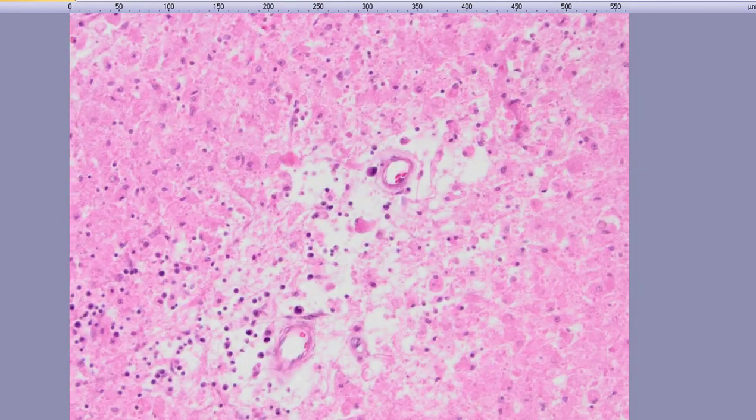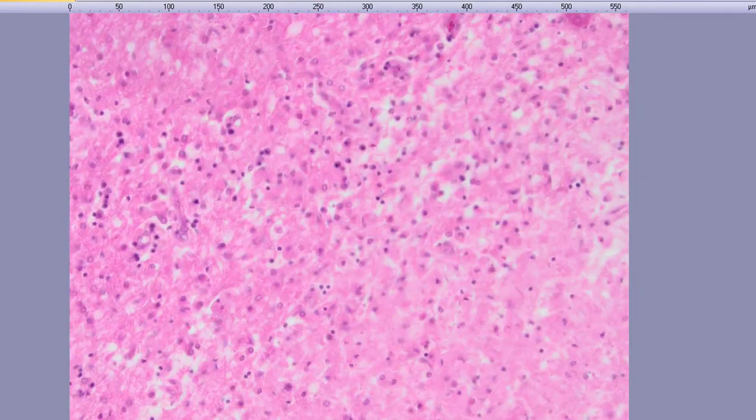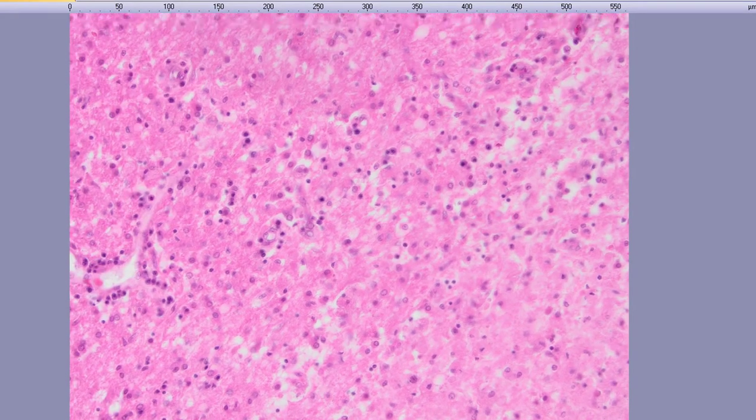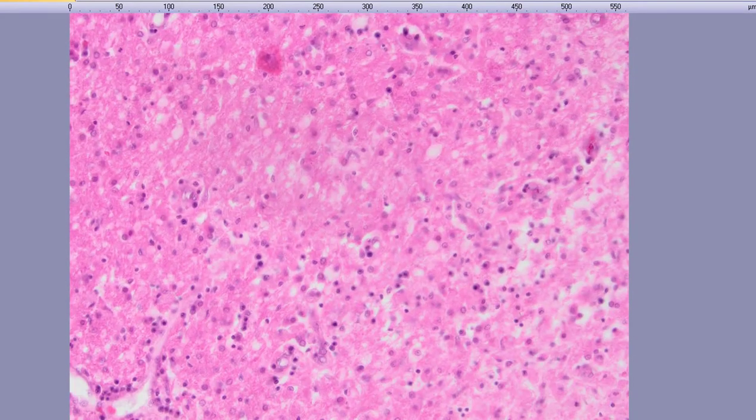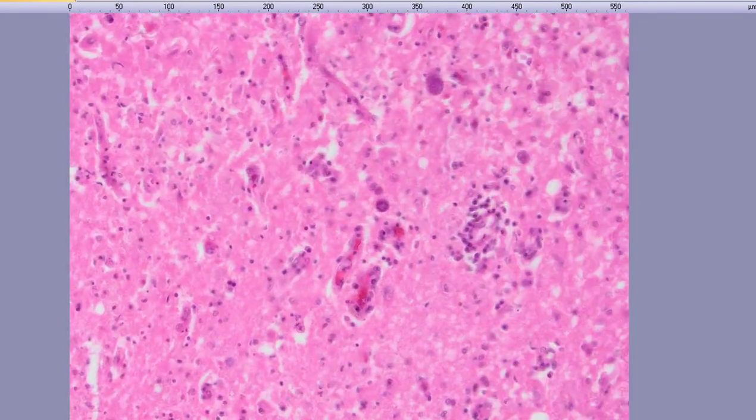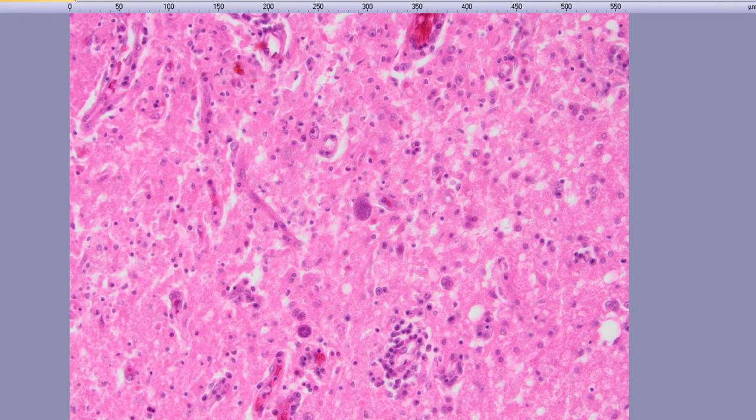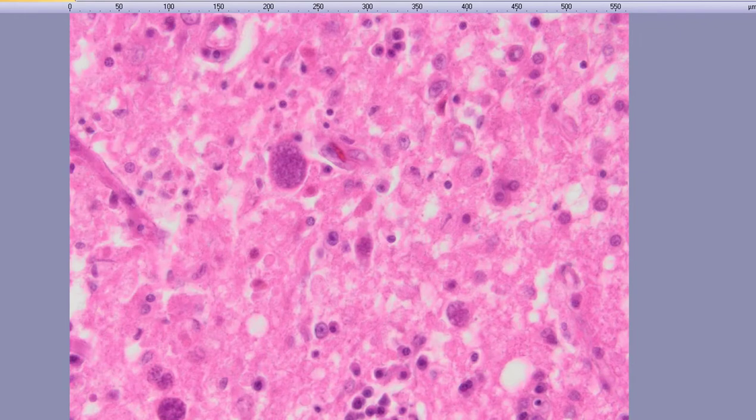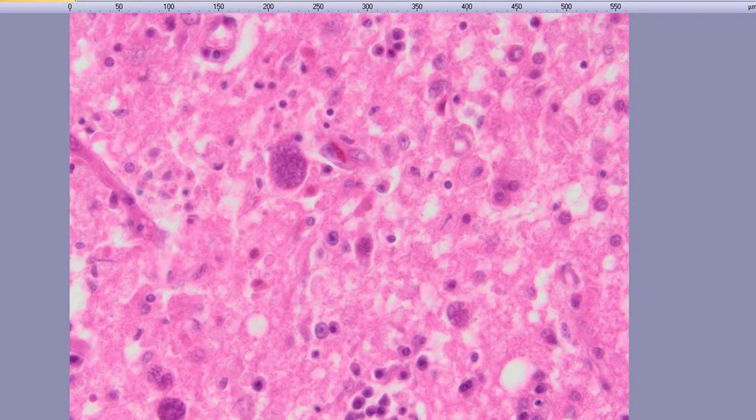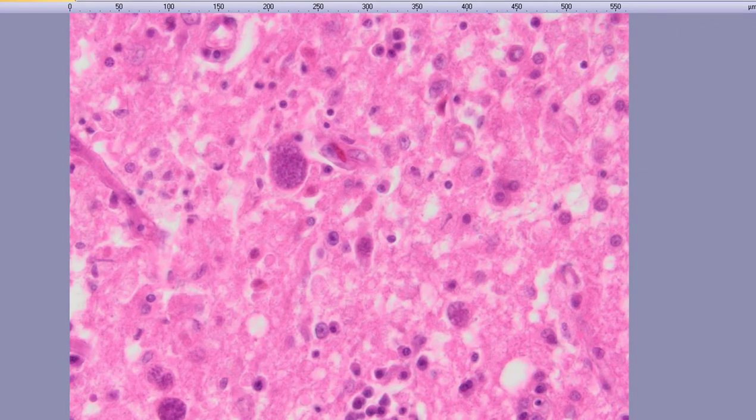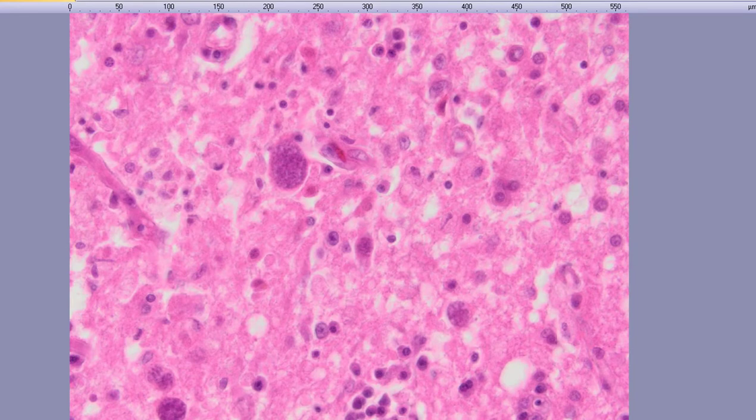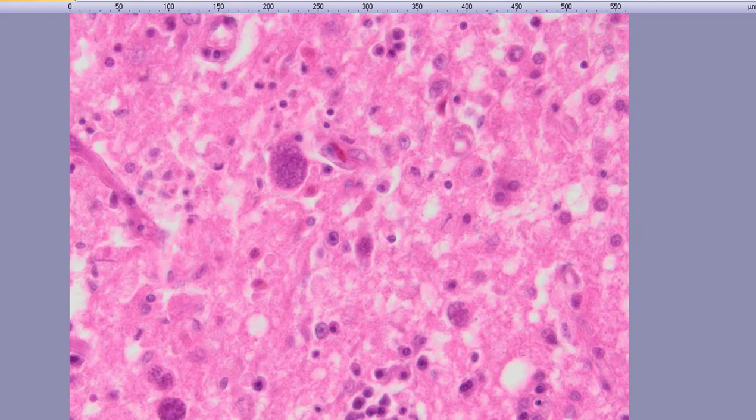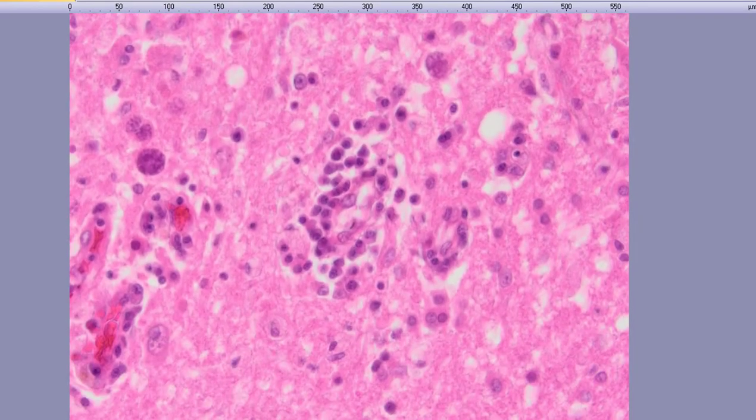When you move on there's an area of more prominent inflammation here, and then at the periphery, these balls again, which I'll tell you are actually encapsulated bradyzoites, cystic cysts, and cystic bradyzoites of Toxoplasma gondii.